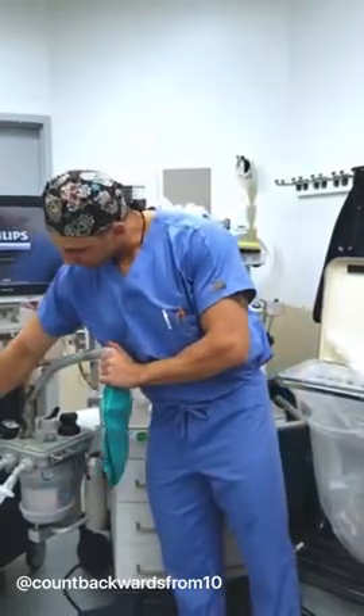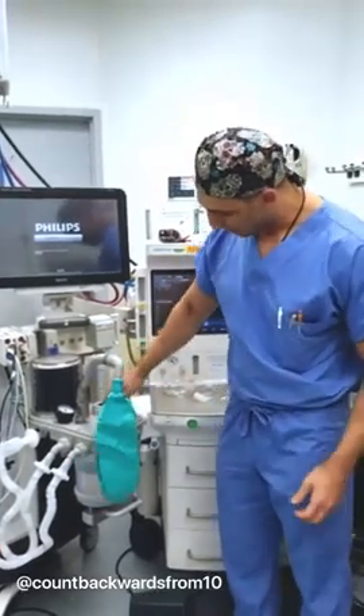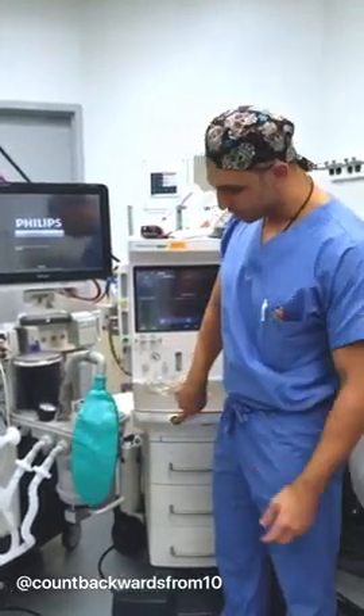Next, you're going to plug your circuit in somewhere so that it's completely closed. You're going to go to manual, close your pop-off valve to 75, and hold down your oxygen flush button.